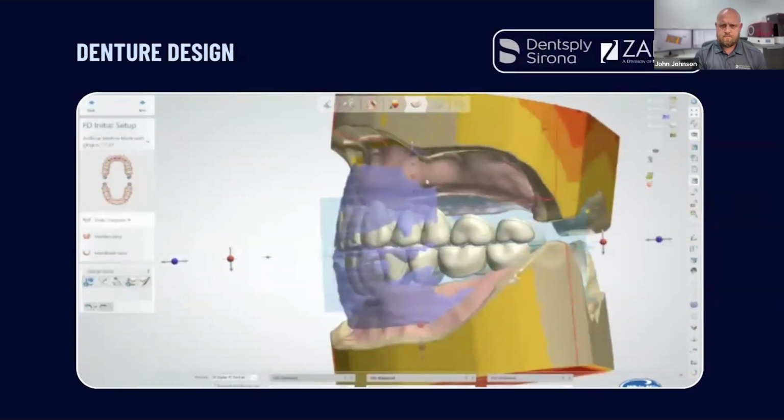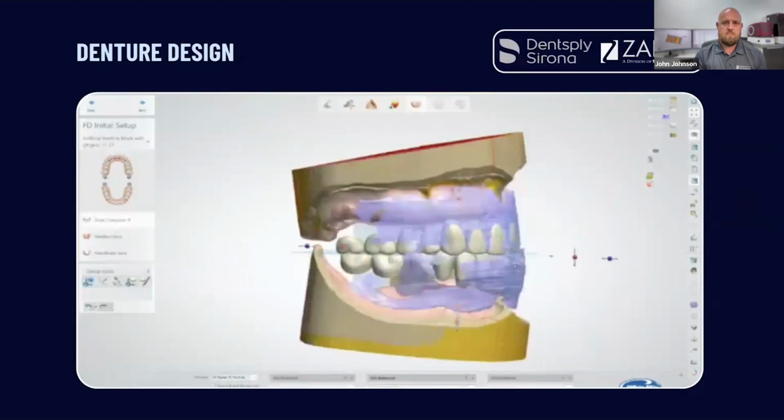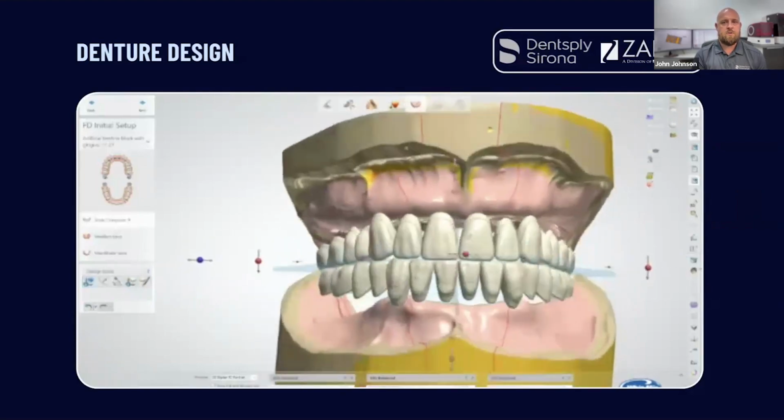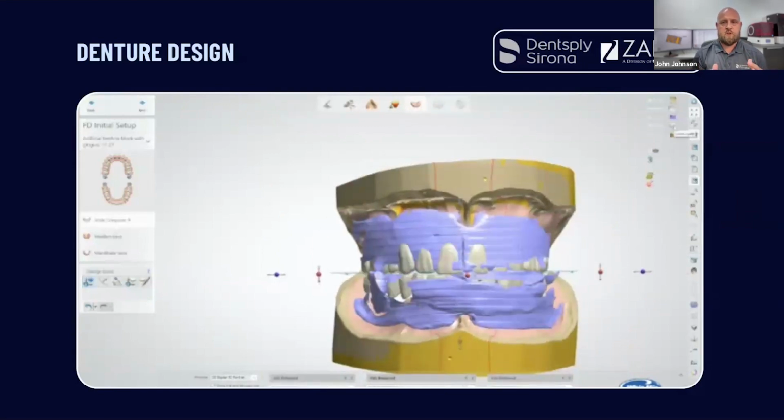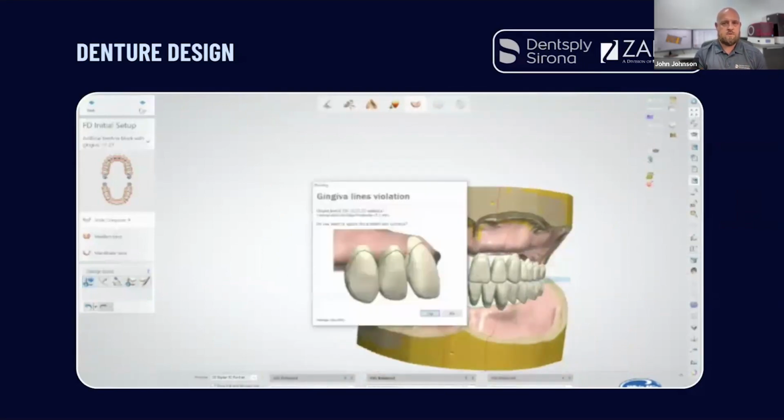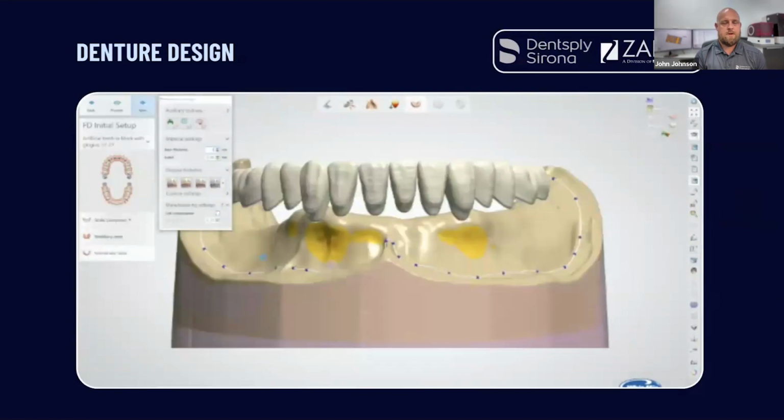Tooth arrangement, movements, side to side, up and down. You can elongate the teeth. You can shorten the teeth. You can use multiple tools. You can customize every single tooth in that arrangement if you would like.